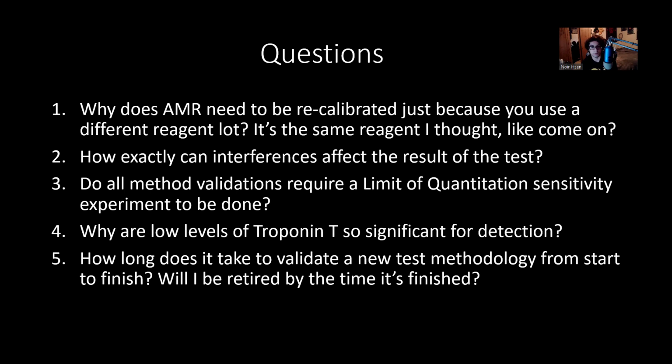Most won't. The Cobas example, when I was in my chemistry rotation, if we had a lipemic sample, it would flag it, and we would have to do a dilution. However, some tests do not require it, or you cannot do a dilution. You'd have to do an ultracentrifugation. But it's just a little example. It can interfere either way or mask it.